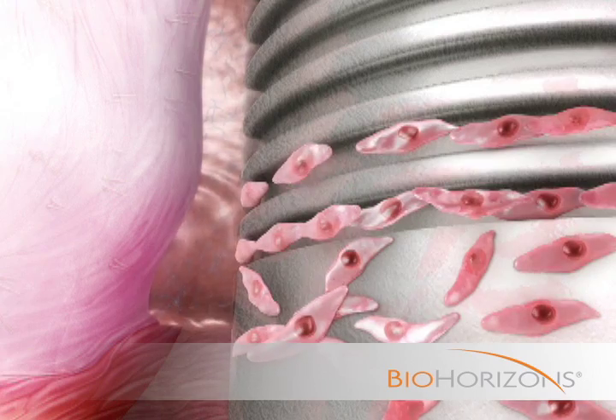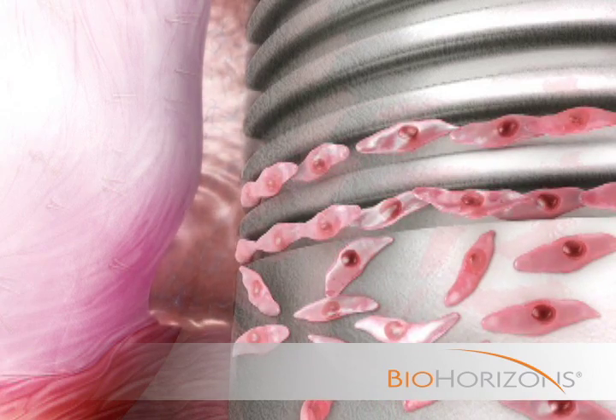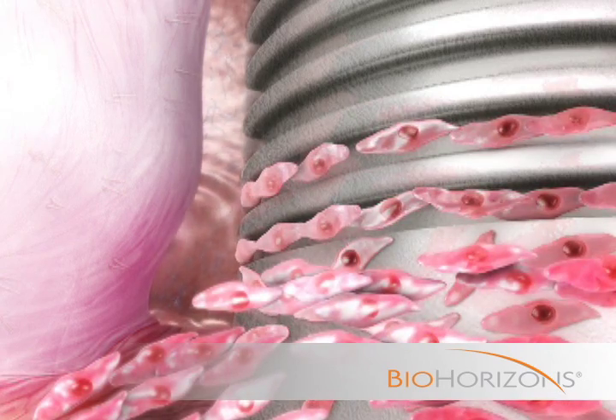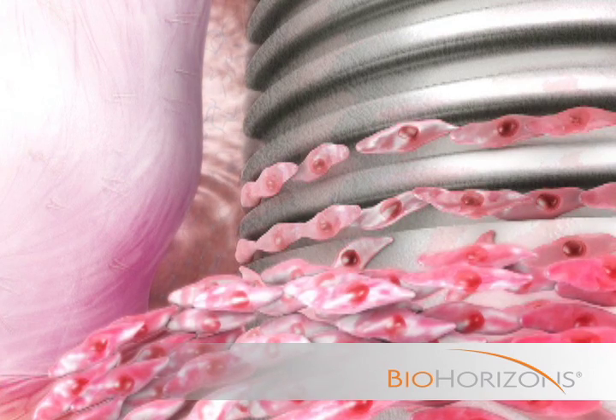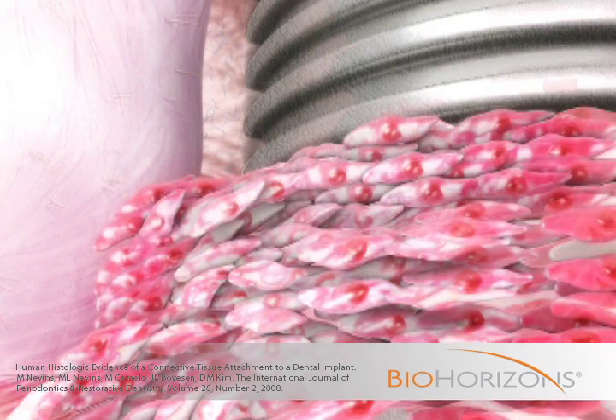The guided cellular response generated by the laser lock technology continues with subsequent layers of epithelial cells, creating organized junctional epithelium successfully integrated onto the implant surface. As a result, epithelial downgrowth is inhibited.